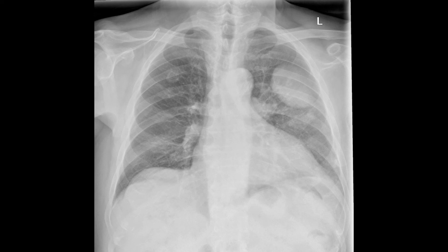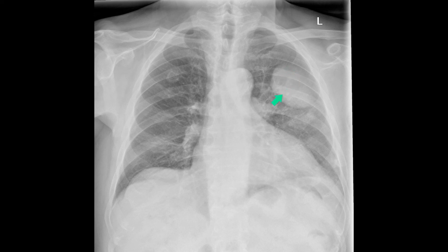Just to recap: this chest radiograph shows a medial sharp border. It fades laterally and superiorly. Here's a co-existing cavitary lung lesion. Note also that the rib anteriorly has gone, because this has been destroyed by the mass lesion.